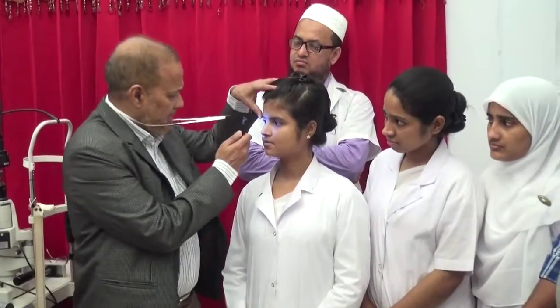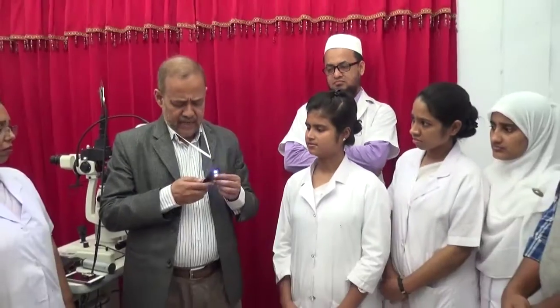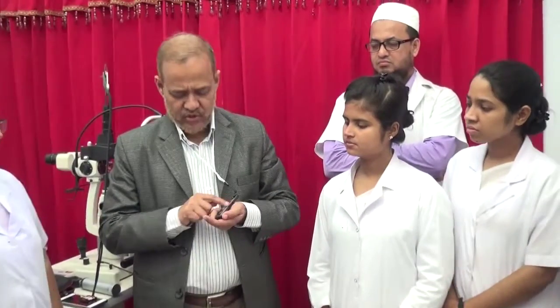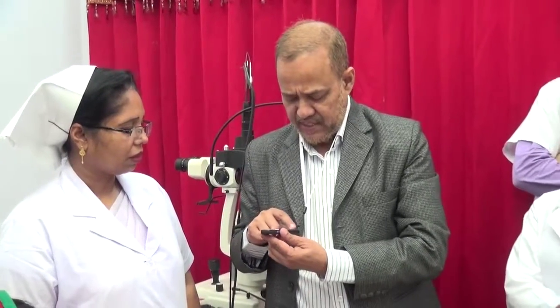Here is the switch — we can just put the switch on the ArcLight. And here is the blue light, which we can use to see the cornea with fluorescein staining. Here is the loupe to see the external area of the eye. Here are the lenses — we can adjust the lens for the ophthalmologist as well as the patient. And here is the white target, the red target, the ruler gauge, the near chart for near vision, the pupil gauge to measure pupil size, and the cup-to-disc ratio scale.